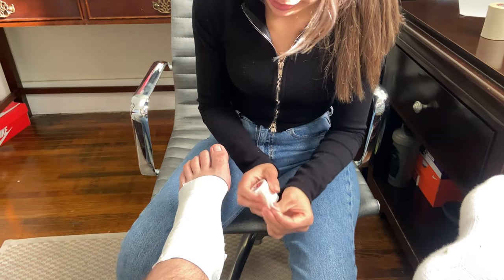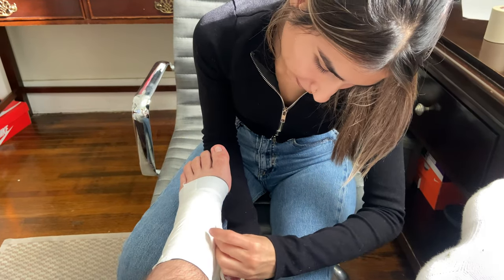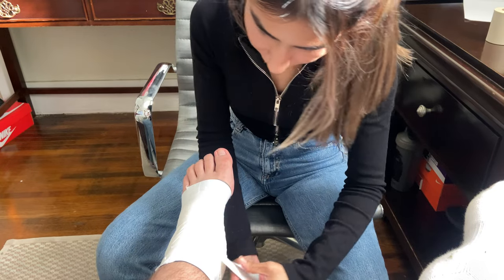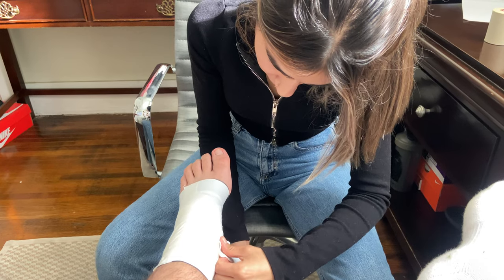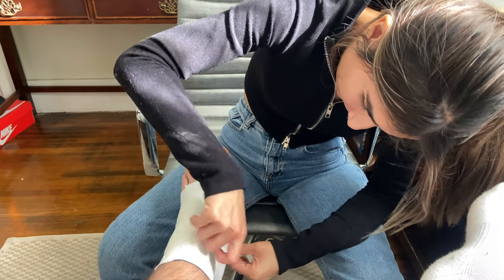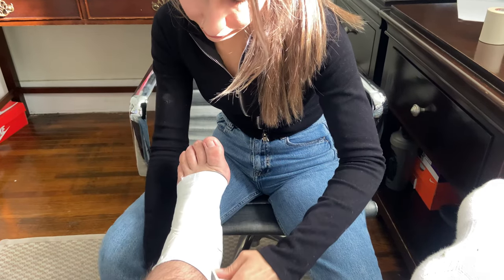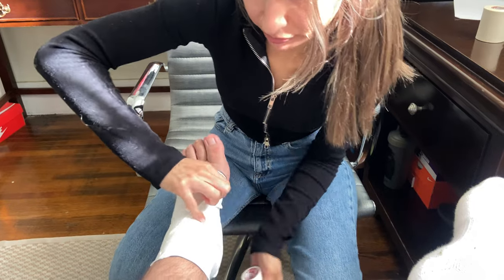So now we're going to go ahead and do it one more time. We're going to start again under the foot, across the top of the foot, behind the ankle, back to the starting point, and over the top of the laces.